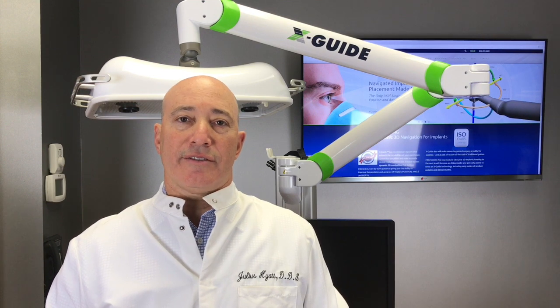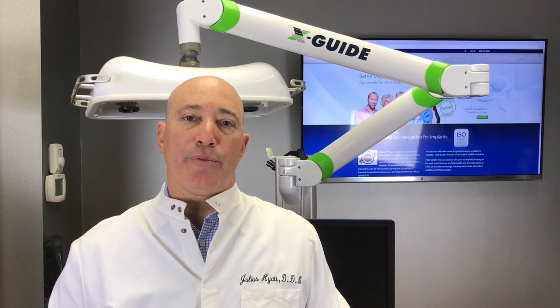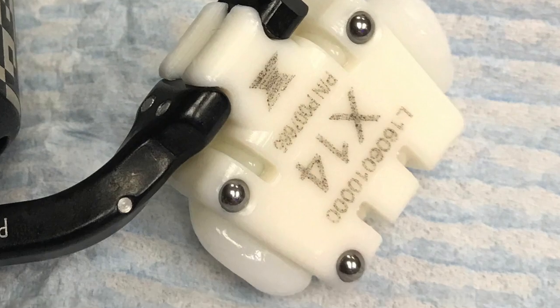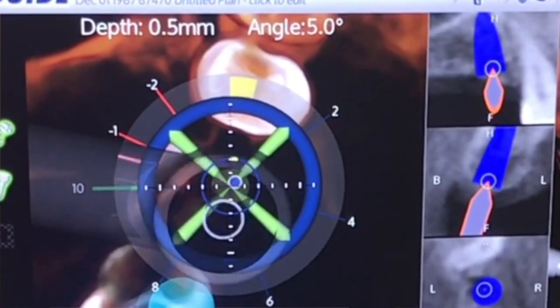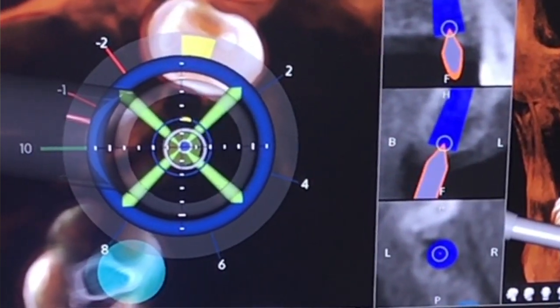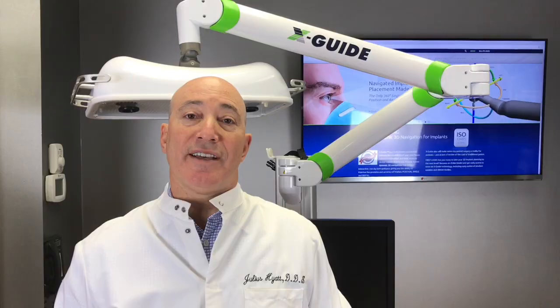The workflow goes like this. You come in for a consultation. We obtain a cone beam scan. Just prior to the scan, we place a clip called an XClip. It's a thermoplastic material, meaning we heat it up and it molds to the teeth. We take the film. The clip provides a reference for the XGuide computer to accurately plan and place exactly where we want the dental implant to go.